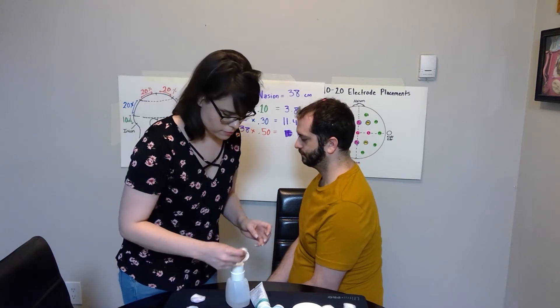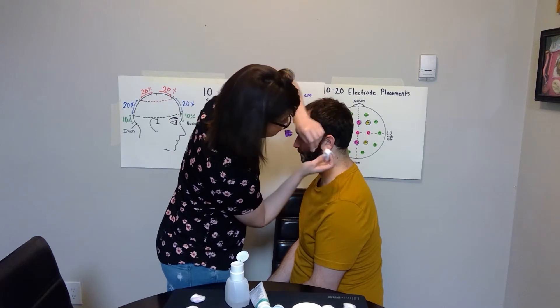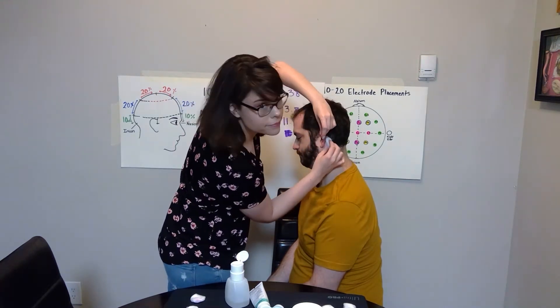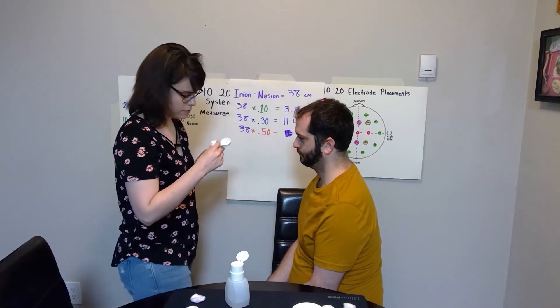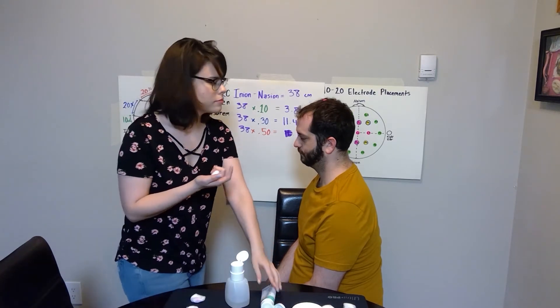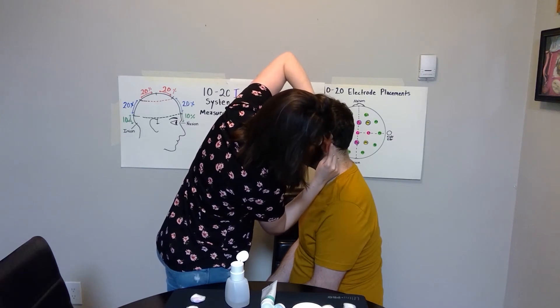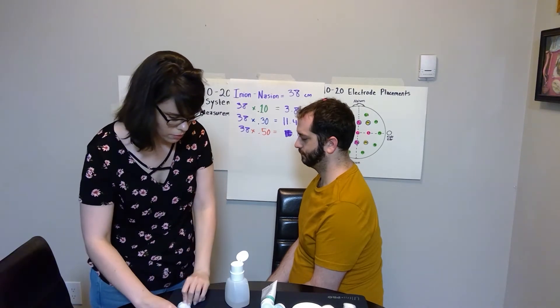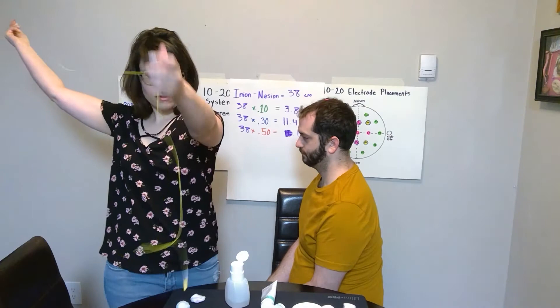Now we're going to do the same for the other side of the head on the mastoid for the other ear. We clean it with alcohol, and then we're going to rub on our NuPrep. I should also mention — when you rub on the NuPrep, you're not going to wash it off, because this NuPrep gel also helps with electroconductivity and will help electrical signals reach the electrode.